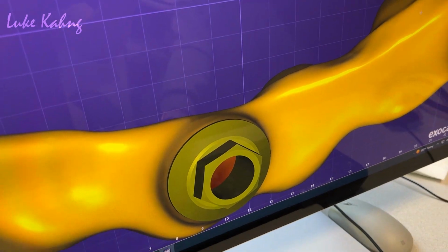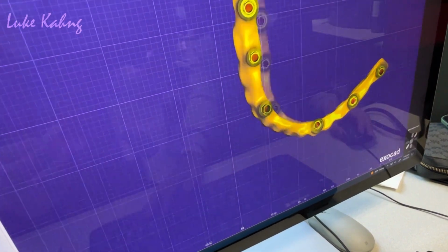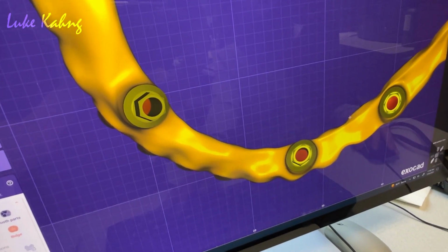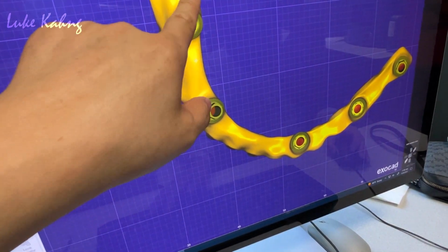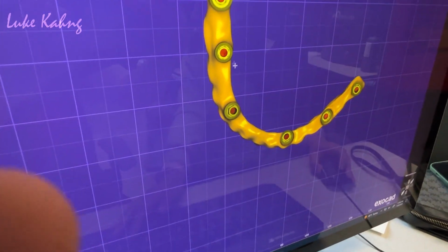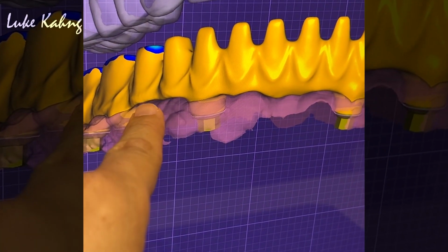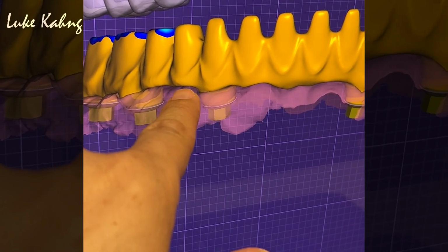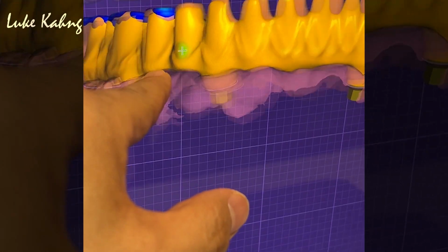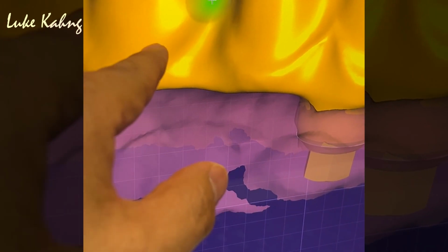Now we're going to cut it. It's way more than this. The other side, that one's good. So this is underneath the pontic, let's finish this. Alright, this is the final, so we make it longer because of the minimum tissue design in between the two. Just take it down. We want to see the tissue, just bring it in. Just a little bit, flat. No, I'm talking about here. Yeah, that's good.